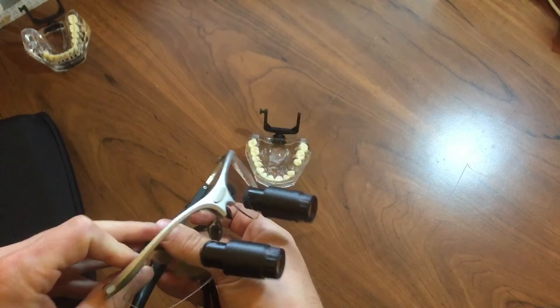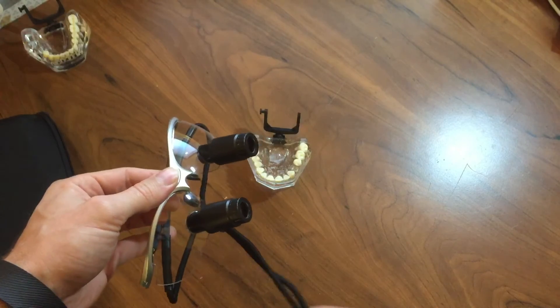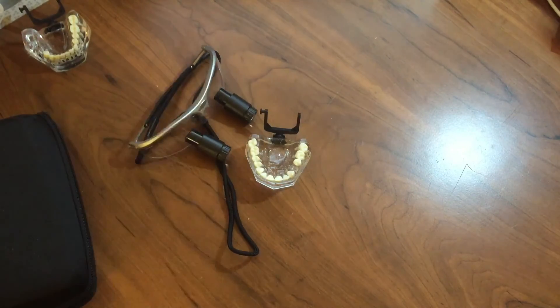The other thing that I'm very, very impressed with is their customer service. I got these loops through Amazon from Schultz Medical and their customer service has been spot on. I emailed them back and forth and they were always quick with their replies. I had gotten a different set of loops but the PD distance — the width of my pupil distance — was not quite right. So I sent it back and they had another one to me in just a couple of days. They're very good, fast shipping, very, very good customer service. I can't say enough about them.